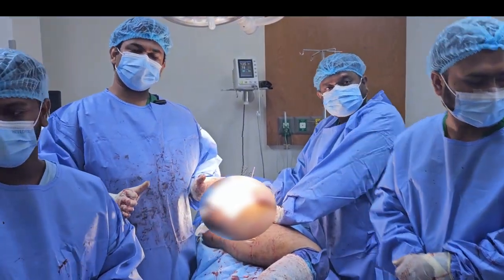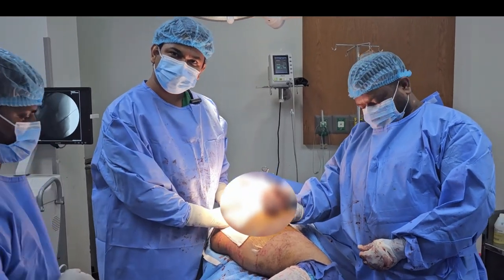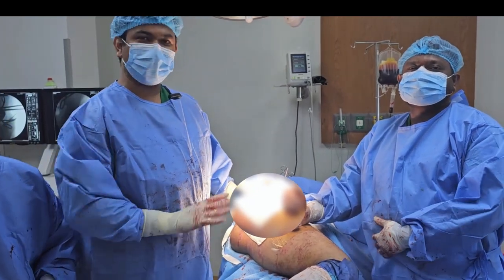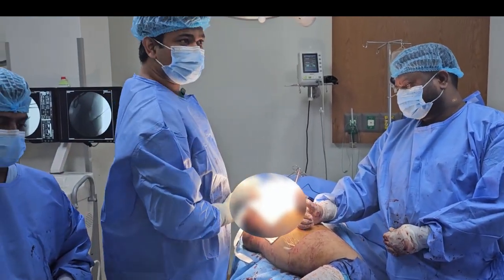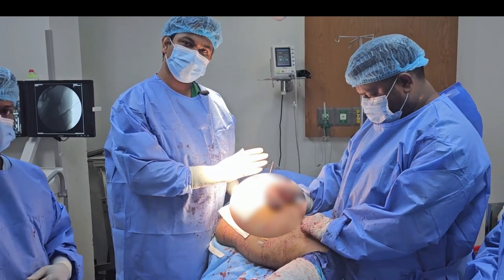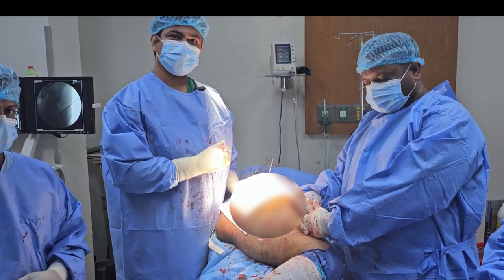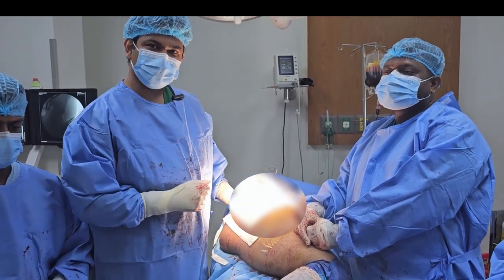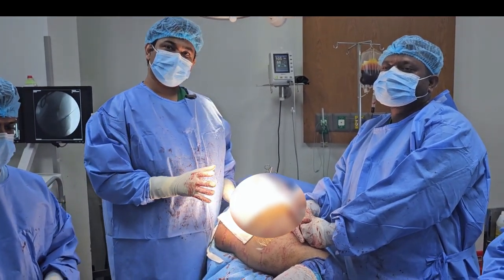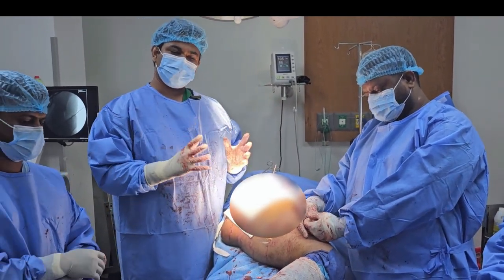We have replaced both the acetabular component and the femoral component — non-cemented — bilaterally, and we have done this fantastically. Using the fluoroscopy machine, we now close skin layer by layer: muscles, capsule, drain, fascia, and subcutaneous tissue. Closing all layers is a vital part of the hip replacement procedure.